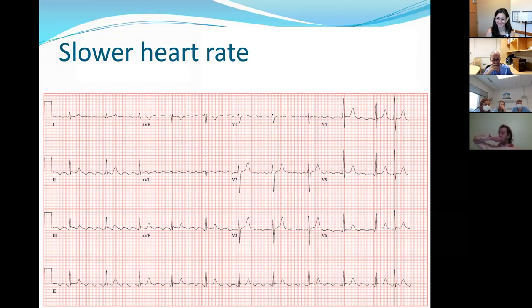Sometimes you have to try and do things to slow the heart rate down or have them naturally slow it down. For whatever reason, flutter tends to come in a little bit more commonly in even numbers, meaning you'll get a 2-to-1 or 4-to-1 or 6-to-1. It's less common that you'll get 3 or 5-to-1, and it's less common that it'll be alternating with a variable conduction pattern like 2-to-1, 4-to-1, 3-to-1, 5-to-1, something like that.